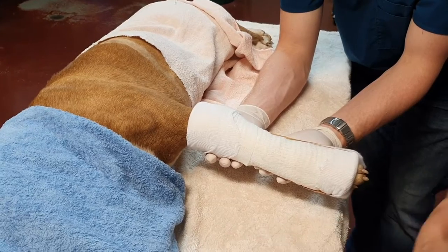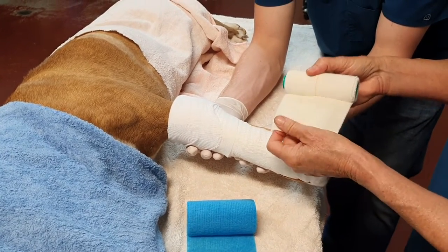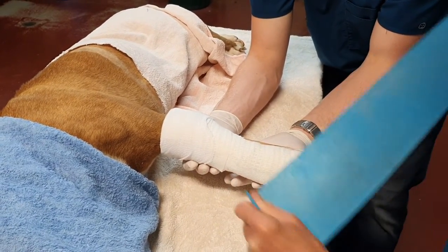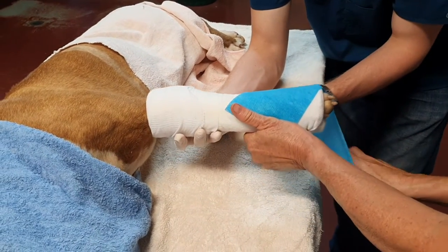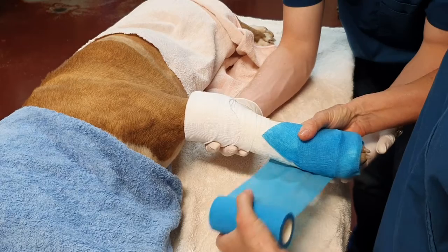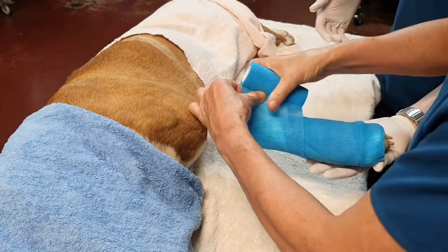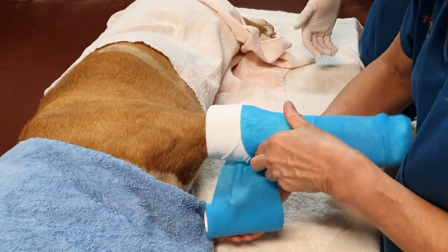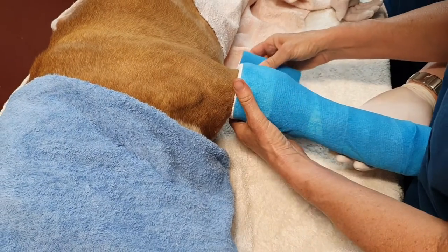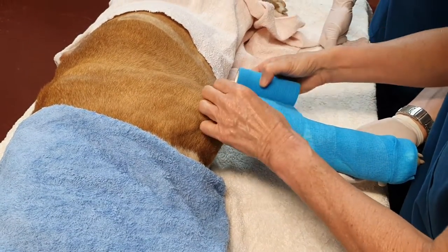The next layer — the final or tertiary layer — can be either vet wrap or the equivalent product, or some people prefer to go straight to elastoplast. Either is fine. I tend to come in at an angle just to cover the bottom of the toes, and again just unwinding it without a lot of pressure — pre-stretching and then unwinding. If I'm using vet wrap, which is stretchy, I do not come past the top of the bandage at this point. If you go past it, there's a risk that we will tourniquet the top of the leg.